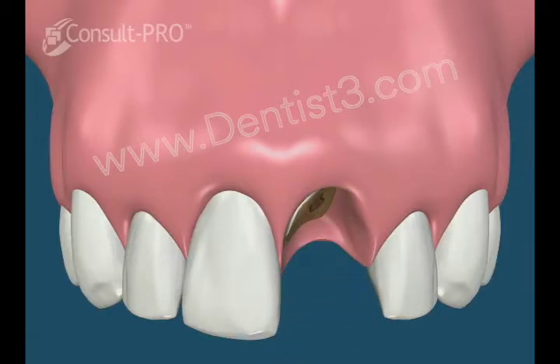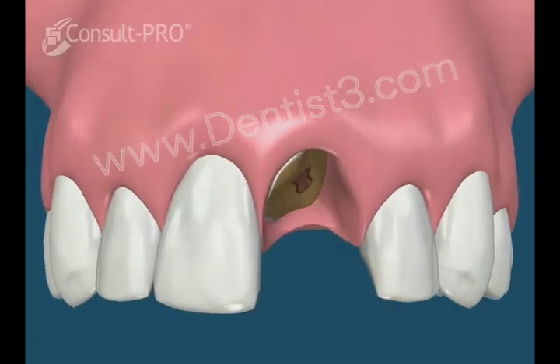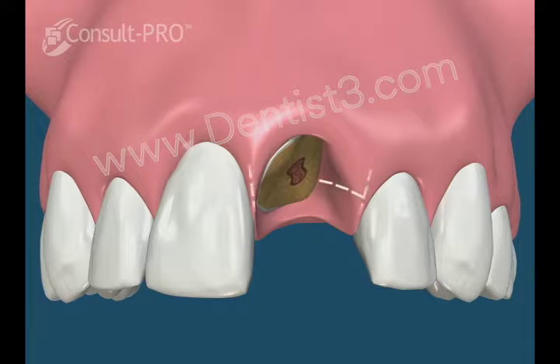This movie shows the extraction of a broken tooth with an implant being placed at the same time as the extraction, as well as grafting.